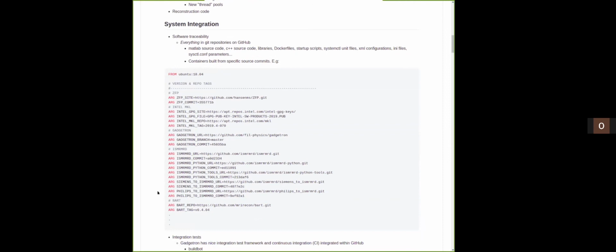Okay, then a few little tips on problems with getting all this stuff to work together, and solutions that my colleagues and I have come up with. I think I'm a jack of all trades and a master of none, so sorry, I won't have come up with the best solutions for anything much. But you at least can identify where the weak links might be and where you want to make sure that you've covered those bases if you want to have a prototyping system that can actually be used robustly.